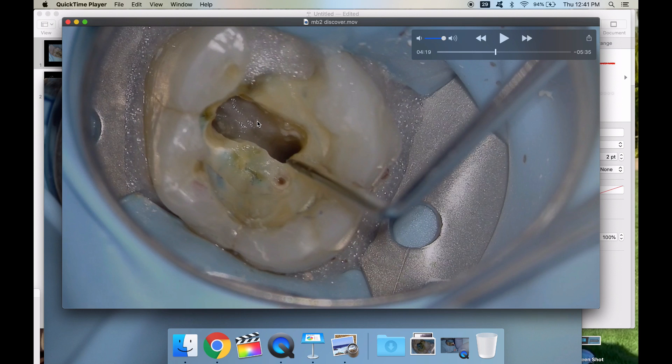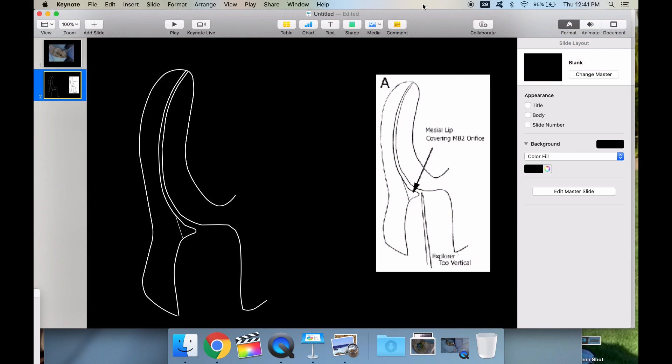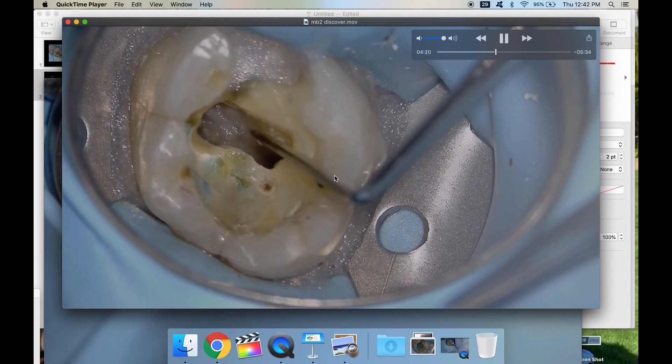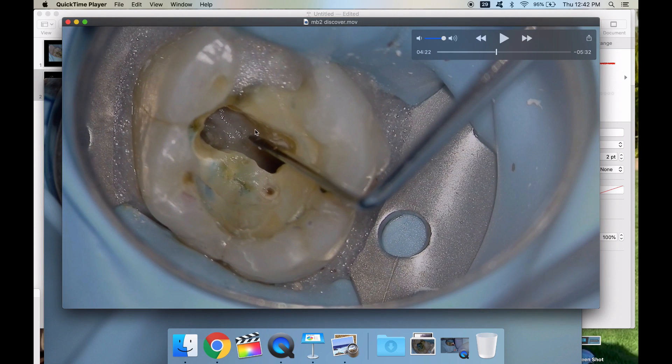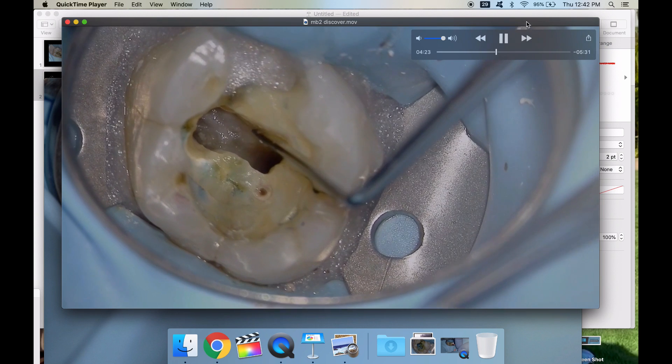You can see it right there next to the developmental groove — it's nowhere near the tip I was talking about. But don't stick a file straight in there — that's the worst thing you could do. What happens is your file goes straight in like that and can't make the bend, so it goes straight. You jam more and more bigger files and it doesn't go around the corner. What you need to do is trough out this lip of dentin — this white lip of dentin right here.